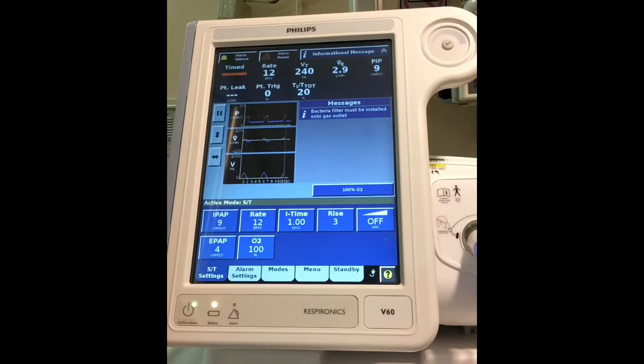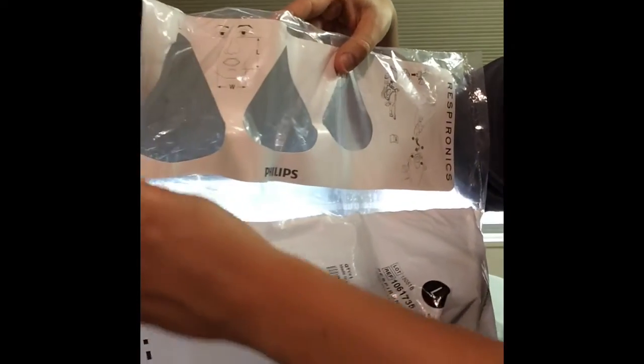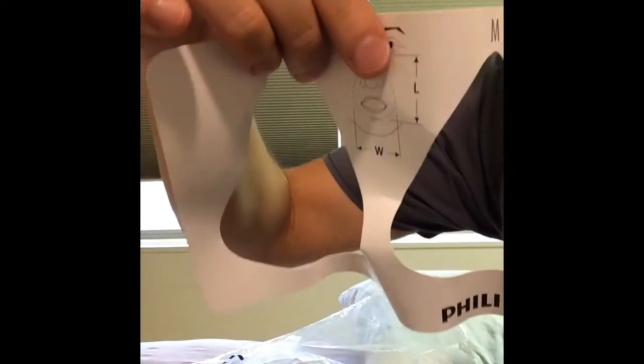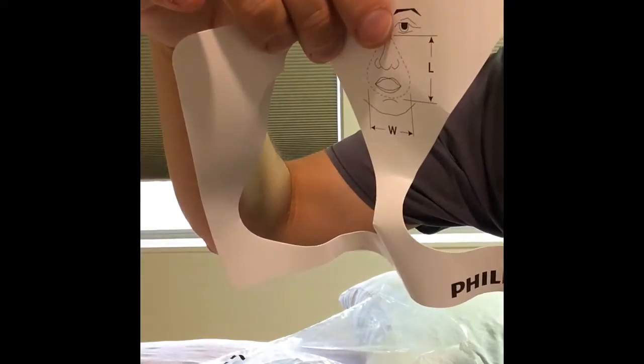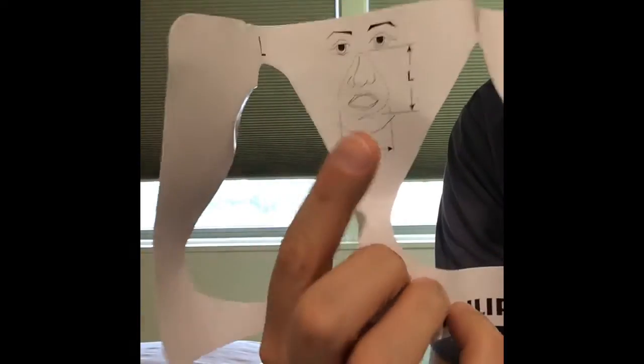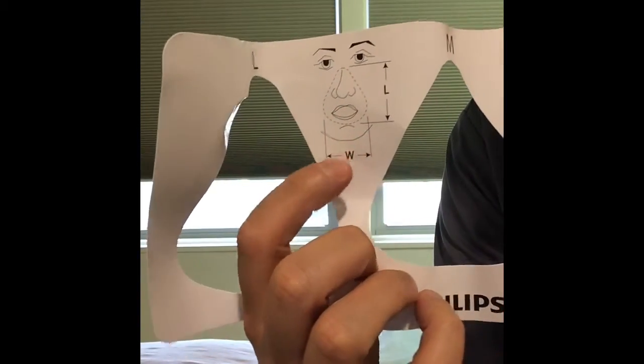Now you want to make sure that you have the appropriate mask, and we'll go over the mask fitting. So once you have your different masks, take out your guide and measure your patient. I'm going to take that guide out, and it will show you a reference on how to size your patient. You want to have that mask up on the bridge of the nose, and the bottom part of the mask should be in between the bottom lip and the chin.